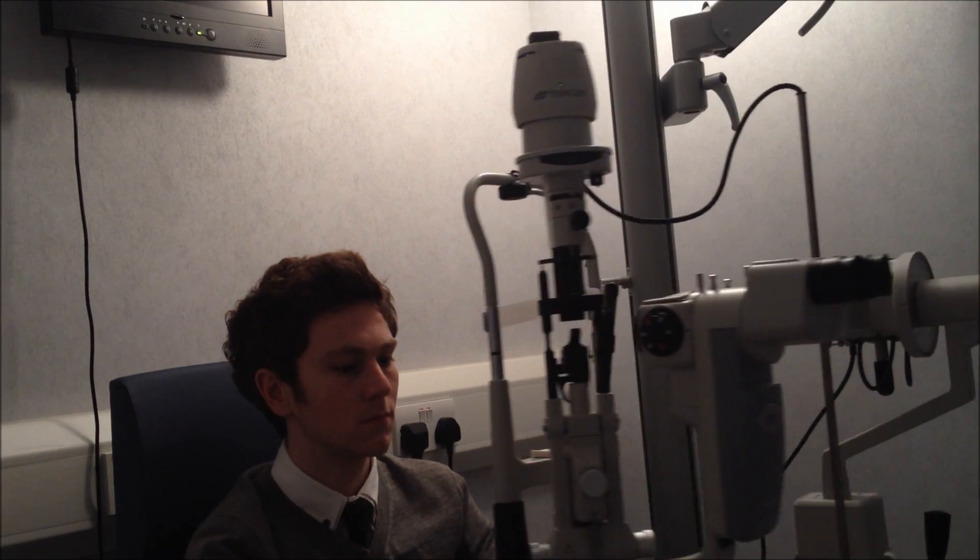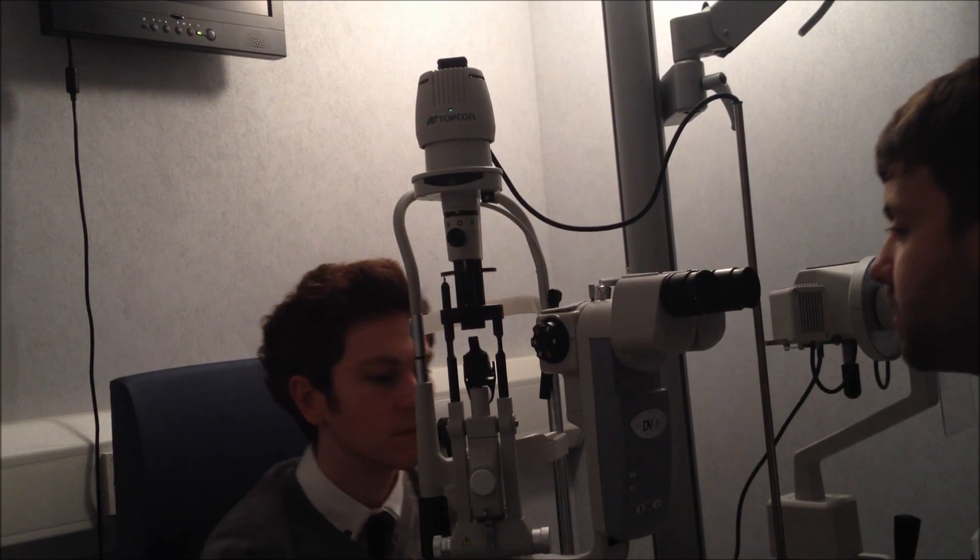The first thing we'll do is just set the patient up, so we'll bring the slit lamp round. Just check the height for him — how's the height for you there, Sean?